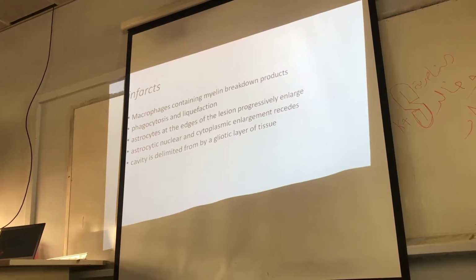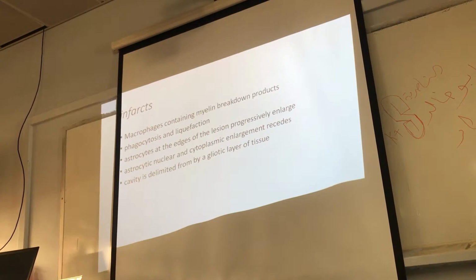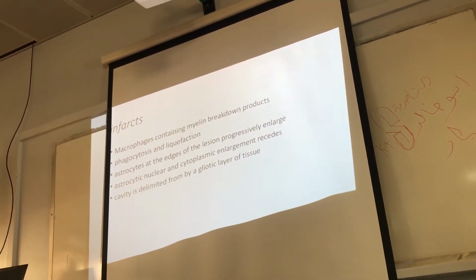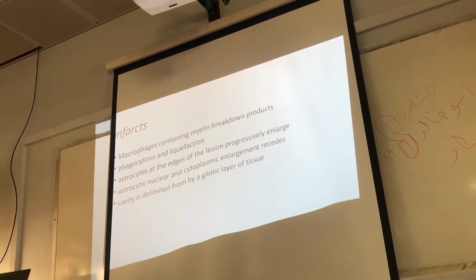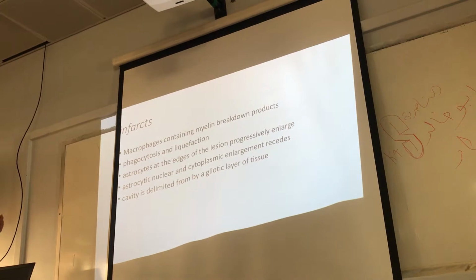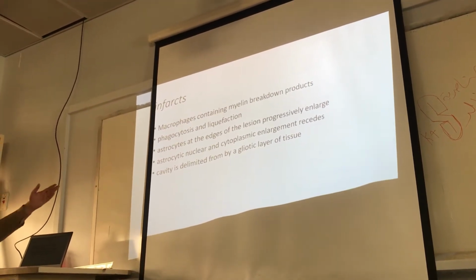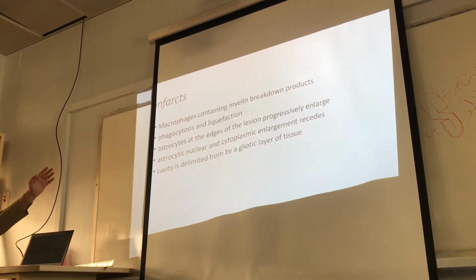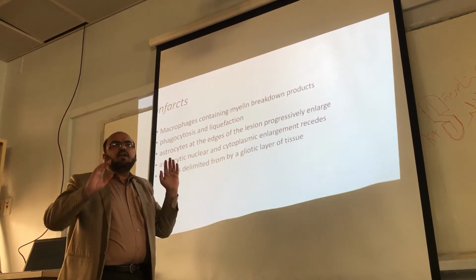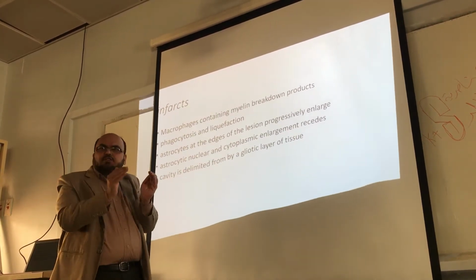What do we see microscopically in infarcts? If there is an infarct, what are we seeing? We have macrophages, we have cystic spaces. The hemorrhages are taken up by the macrophages. There is loss of neuronal substance, and for the repair, astrocytes come. They start becoming large to form the repair, gliosis. Initially they enlarge. Later, when they have deposited glia, this enlargement becomes small again.